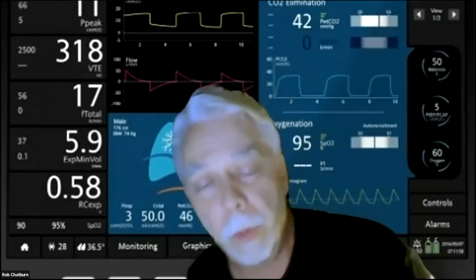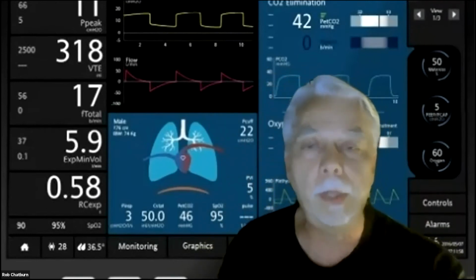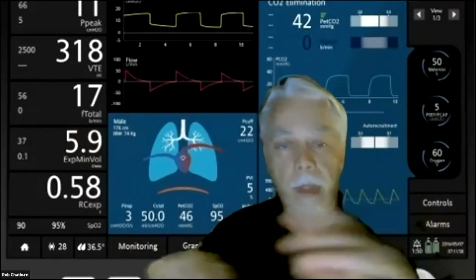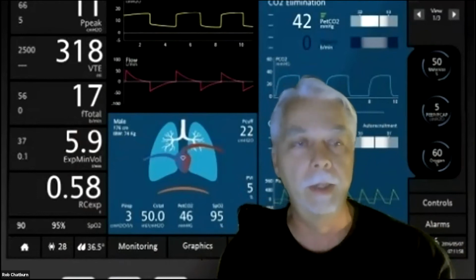Yeah, and furthermore, that's just a single compartment model. If you're talking about a multi-compartment model, now you're probably talking about multiple peaks, right? Some alveoli are below the threshold, and some are above the threshold, and some are in between for the same breath. So it's much more complicated than our brains can really appreciate, I think.